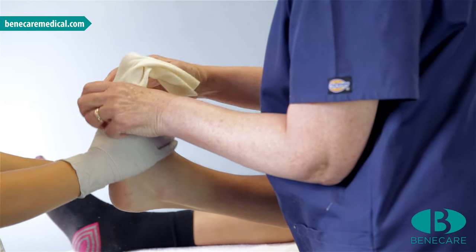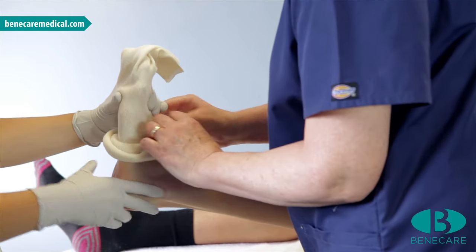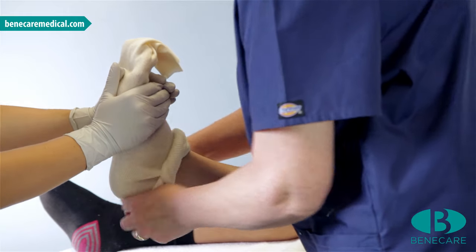Apply the stockinette from the toes to the tibial tuberosity. Ensure it is smooth throughout with no wrinkles.